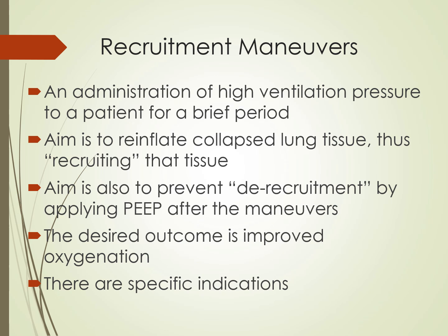When I say PEEP, I'm not talking about a PEEP of 5 or 10. I'm probably talking about a PEEP of 15 to 25, all based on the type of patient you're using it on. The desired outcome of a recruitment maneuver is to improve oxygenation, and there are different ways of doing it, which I'll explain, some basic types.